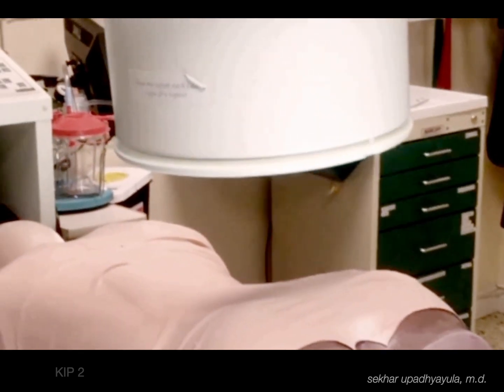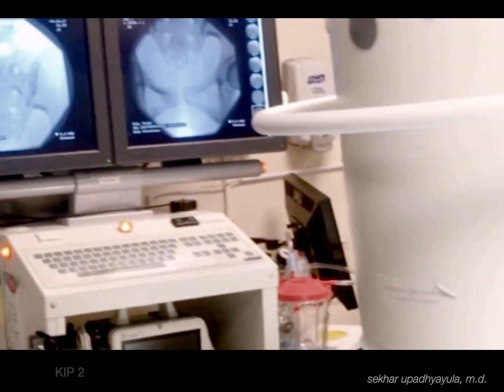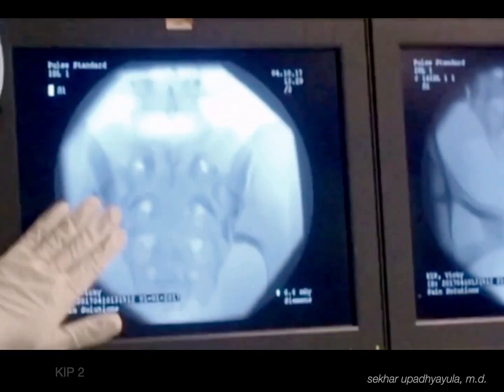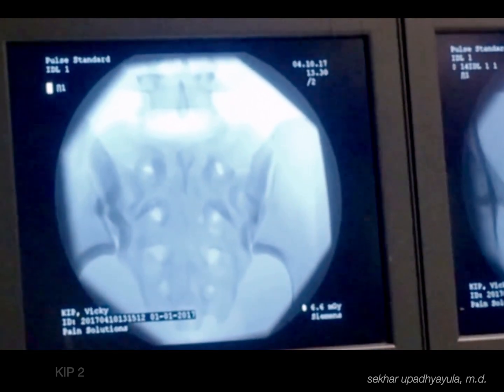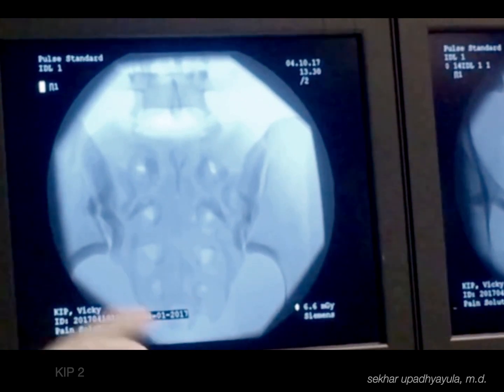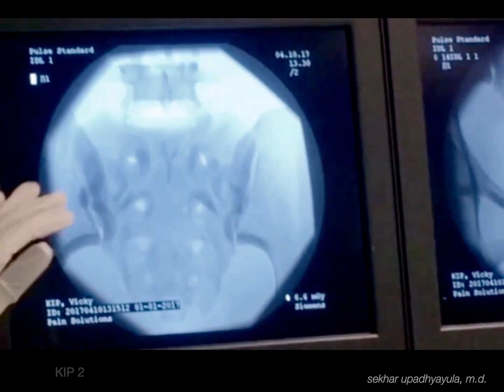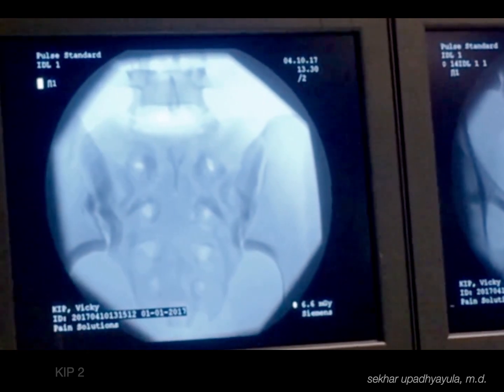And let's have a picture looking up a little bit more. And this is nice. We can see the full sacrum here. And to be fair, if we had a patient where this was actually showing this kind of anatomy, it's wonderful. Patients have such variations in anatomy. However, the most important parts are easily seen.